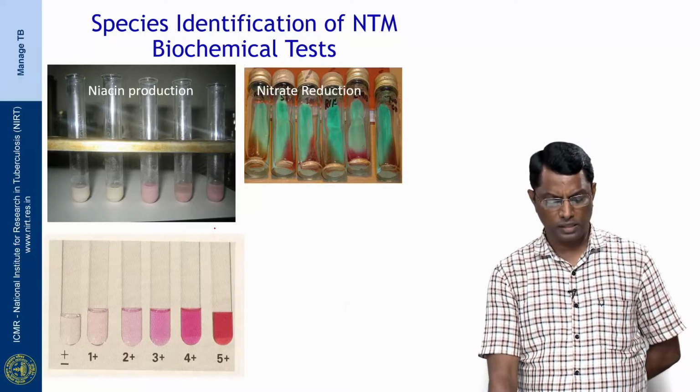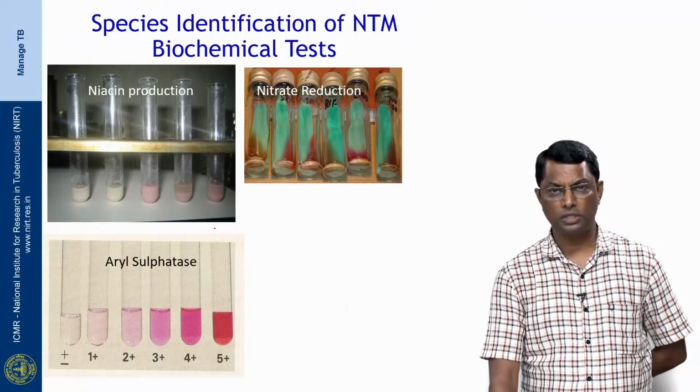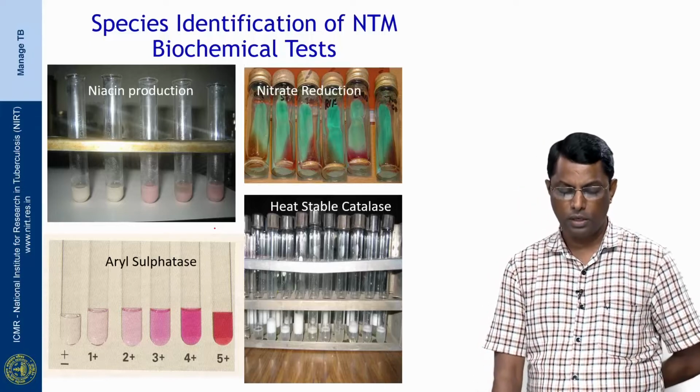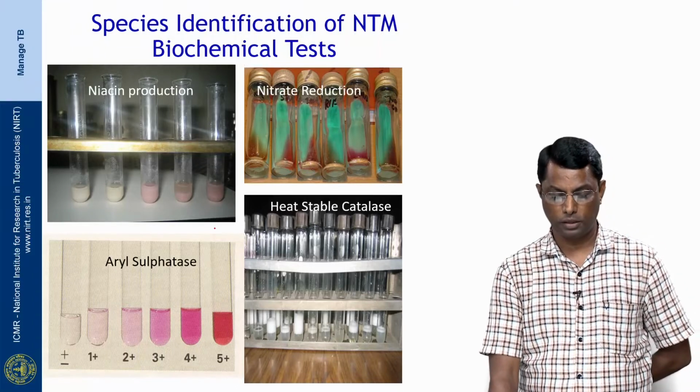So, there are other tests like aryl sulfatase, which differentiates between Mycobacterium tuberculosis and non-tuberculosis Mycobacterium, and there is the heat stable catalase test, which also differentiates between the Mycobacterium tuberculosis and non-tuberculosis Mycobacterium.